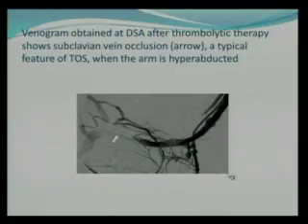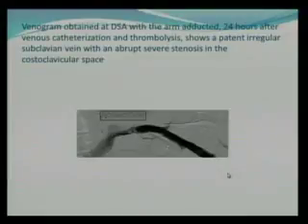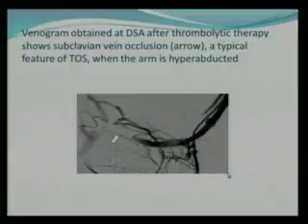So if you don't suspect thoracic outlet syndrome in those subclavian arteries, subclavian veins, there's no way you will do the maneuver. You will not do a stress maneuver to prove it. This stress maneuver can be done comfortably with ultrasound also. It really starts at the clinic when they are able to palpate a radial pulse, and then they ask the patient to do these stress maneuvers, and they're no longer able to palpate the radial pulse or able to palpate a feeble radial pulse compared to the contralateral side. But if you are able to do this, this is diagnostic.